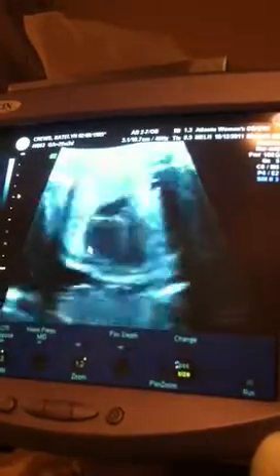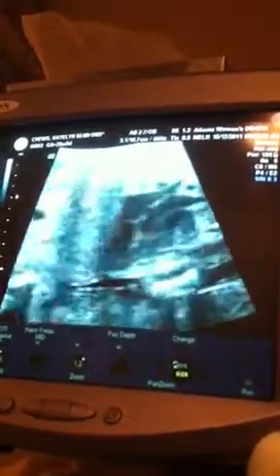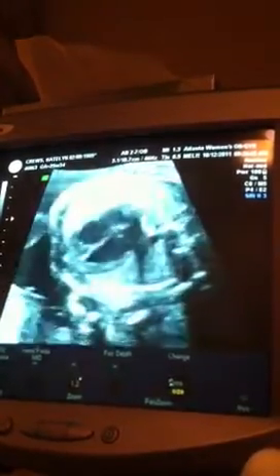So all four chambers there. Take a look. Good number. Brain and heart. See your little ribs there. So we check the four chamber views and then we check and make sure the blood vessels are positioned on the correct side. There's the other one. We got this view last time, but since I'm seeing it again today, we'll just check it again. Everything in the heart looks good.